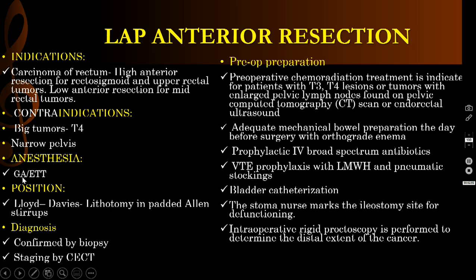Anesthesia, of course, we have to give general anesthesia with endotracheal intubation. Position, you have to put the patient in Lloyd Davis position, that is modified lithotomy in padded Allen stirrups. Diagnosis should be confirmed by biopsy and staging should be done by contrast enhanced CT scan.